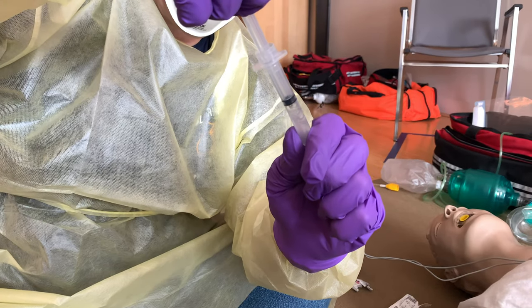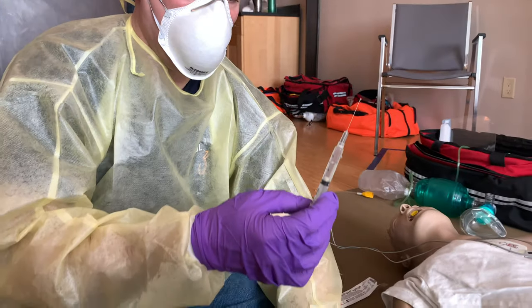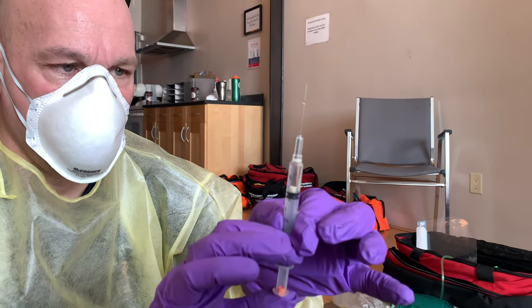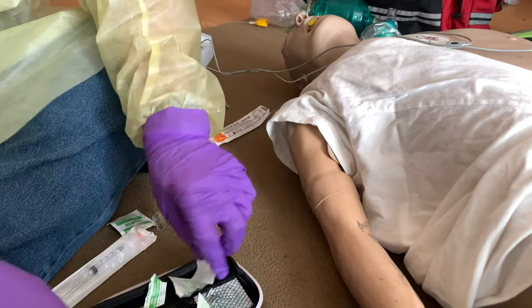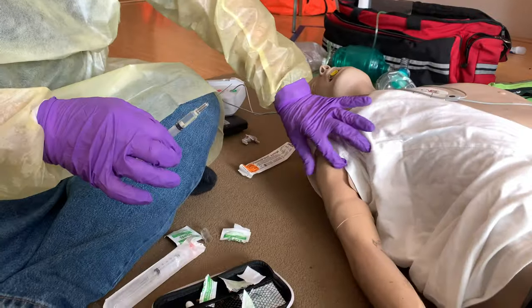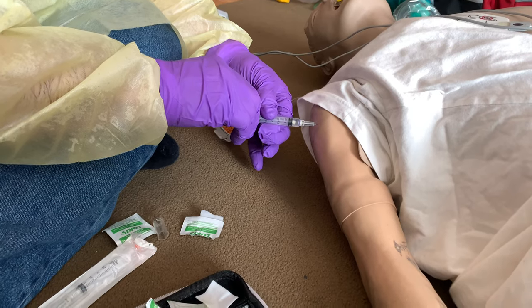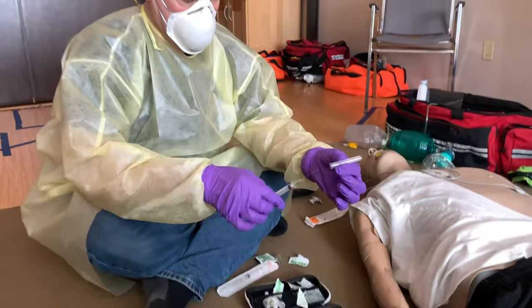Bubbles usually indicate you're near the end of the vial. Try to squeeze out most of the air, but don't worry if there are a few bubbles remaining. Wipe the area with an alcohol prep. Inject into a large muscle — the arm, the pectoral, or the thigh. Go straight into the muscle and slowly inject the naloxone inside. Cap the needle safely.